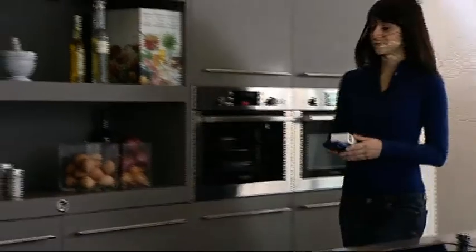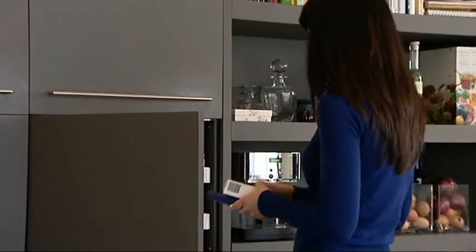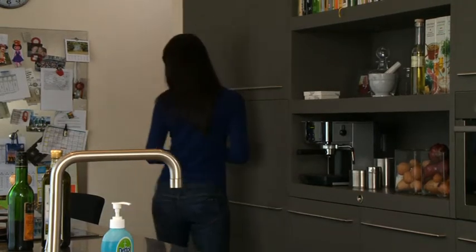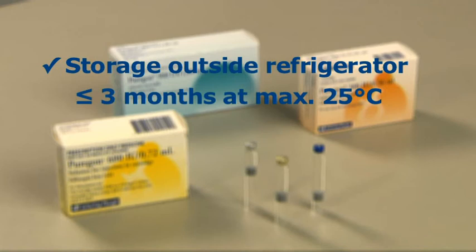Puragon cartridges should always be stored in a safe place. The Puragon cartridge can be stored in the refrigerator at 2 to 8 degrees centigrade until the expiration date on the cartridge, or alternatively at or below 25 degrees centigrade for 3 months or until the expiration date, whichever occurs first.